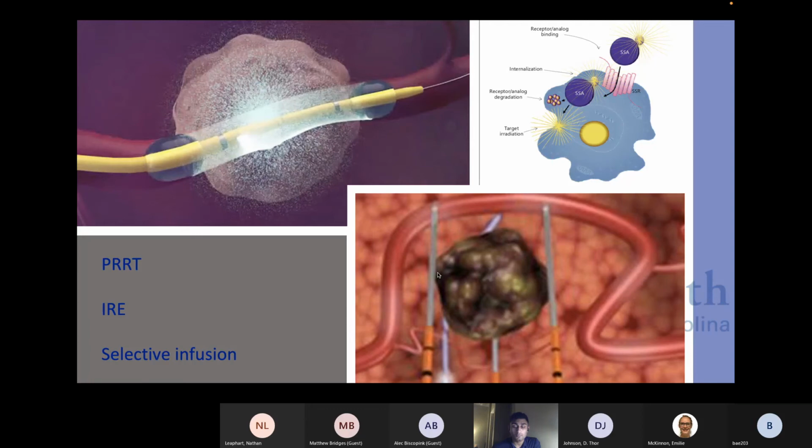And the beautiful thing about it is it doesn't actually cause any thermal damage at all. And so in places with huge blood vessels going through it, i.e. the head of the pancreas, where patients can be non-surgical candidates because there's too much vascular involvement, you can put in your IRE probes. You kill all the cells in between the probes. You just put them on heparin for a few days. And despite the fact you've killed all the cells in those arteries, the cells will actually grow back as long as they don't thrombose. And so you put them on heparin for a few days and then they re-endothelialize after a few days. So even though there are blood vessels that you can't kill because it would kill the patient going right through these tumors, you can still ablate the tumors because you get an extra safety margin related to this IRE.